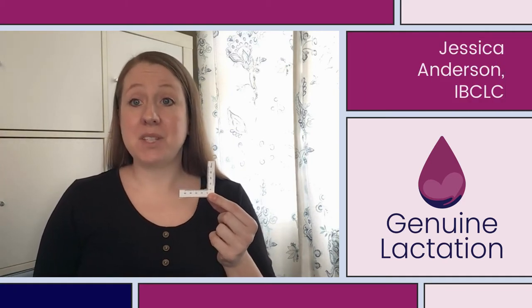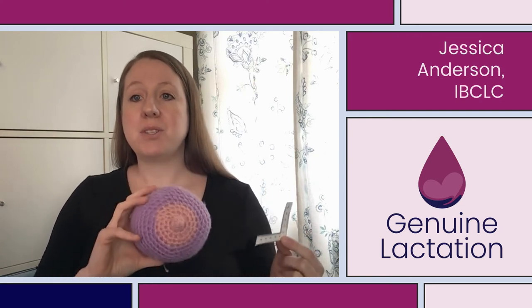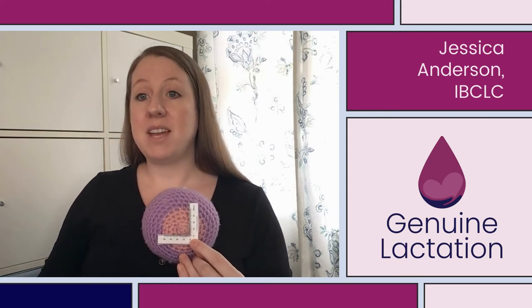This is the Genuine Lactation L-shaped nipple ruler, and it's designed to help us measure the height and the width of the nipple simultaneously so that we can get the most accurate available measurement for virtual fitting. You're going to align this ruler against the base of the nipple — right up against the bottom of the base and the side of the base — so that we can measure it.